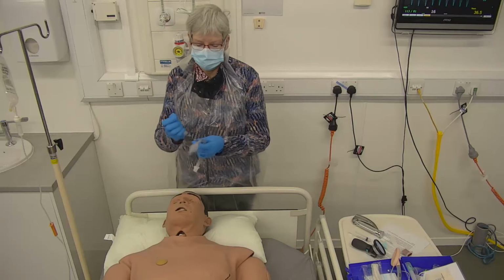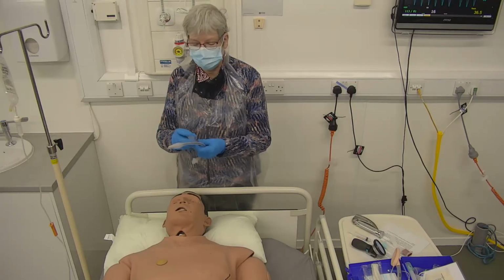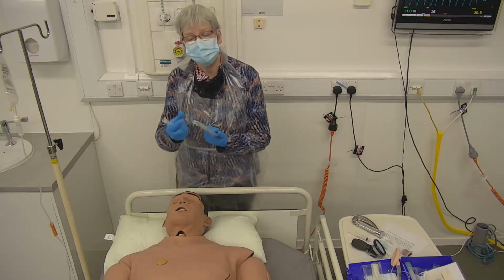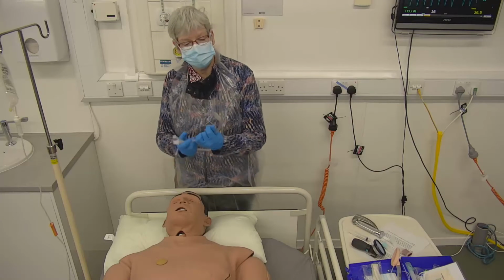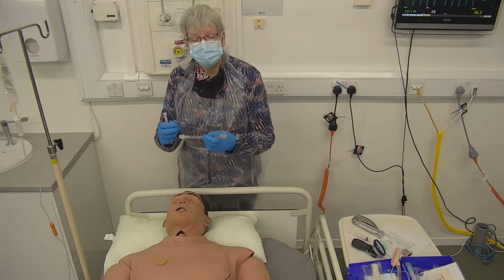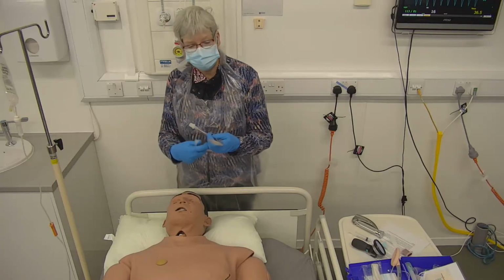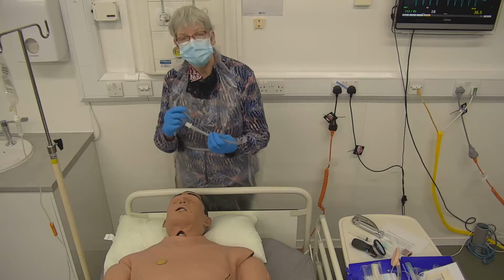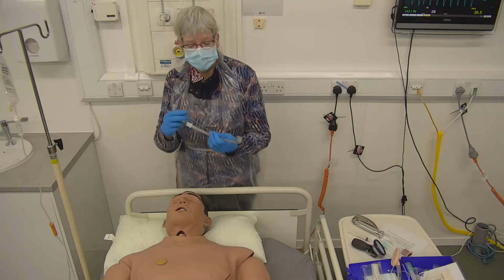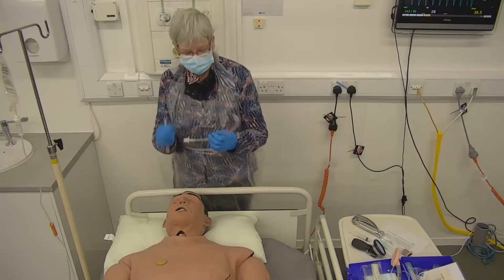The thing is, what we don't want is the balloon to be too down, otherwise we will have a large air leak around that securing balloon, and it will mean that the person is not so well ventilated. It depends on the state of the patient. Sometimes we put these down in order that they can wean and begin to do some of the work of breathing for themselves. But when somebody is fully ventilated, that should be nice and sealed.